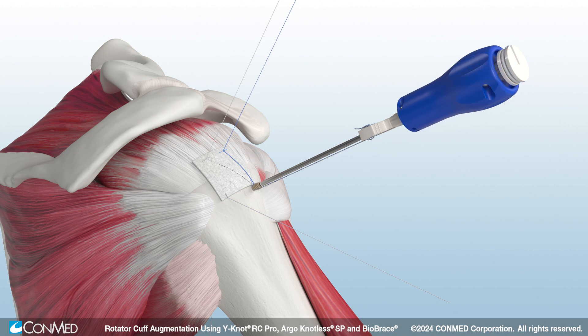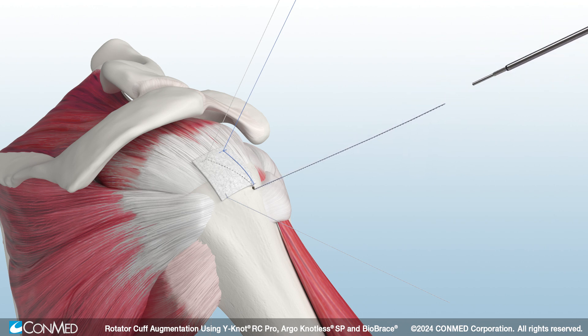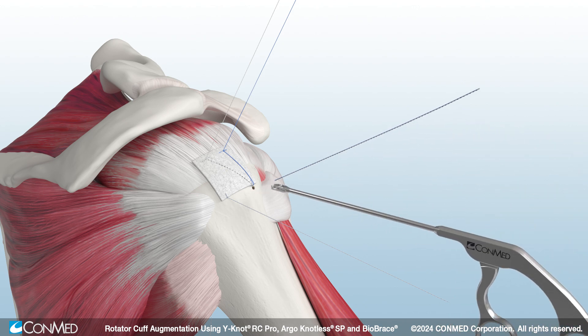Adjust suture tension and cleat the suture on the white smart tension cleat. Hold the white cleat and turn the blue handle clockwise to insert the anchor to the laser line. Then uncleat the sutures from the white cleat as well as the retention ribbon on the back of the handle. Simply press the quick release button to disengage the driver.